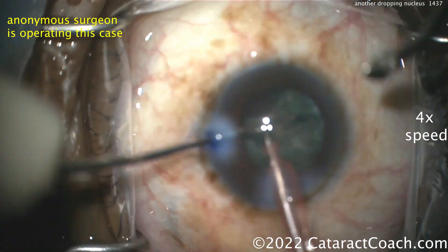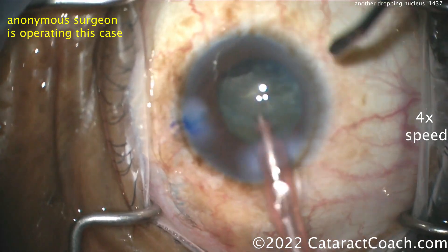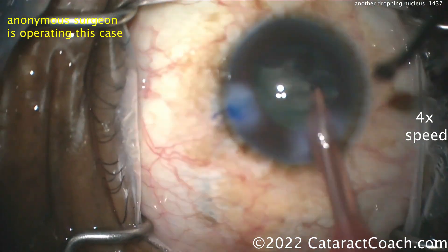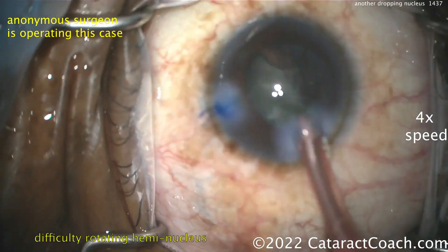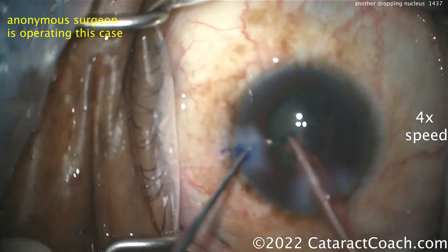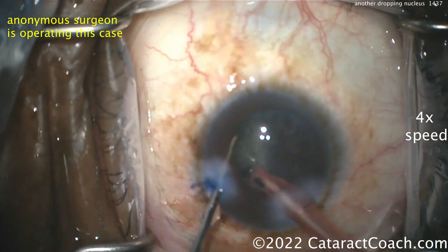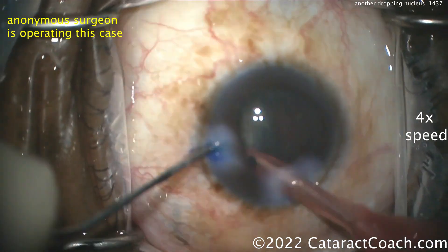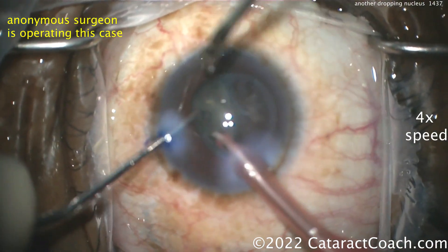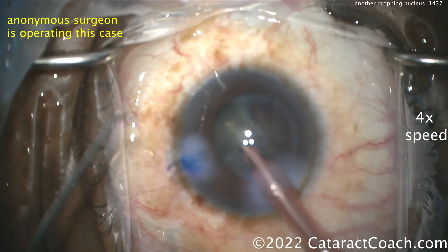It's a little out of focus, but it's an important lesson — that's why I'm showing you this video. Two days ago we had another case of a dropped nucleus. You can see there's a lot of difficulty in rotating that hemi-nucleus. It just does not want to rotate — and what does that tell you? It's probably engulfed in vitreous, or it's stuck on an irregular part of the capsule, or the posterior capsule is open.